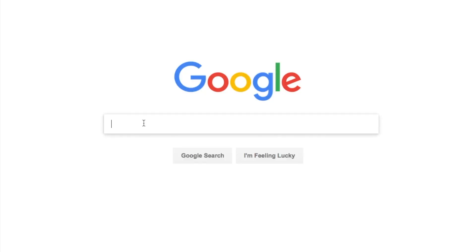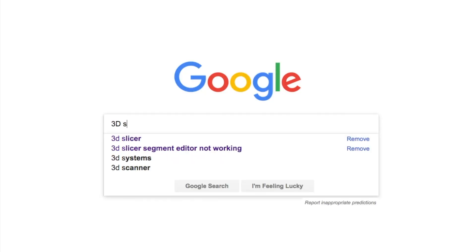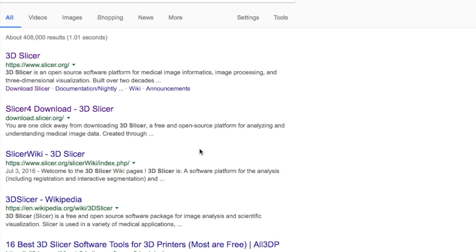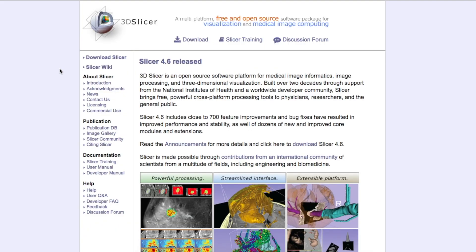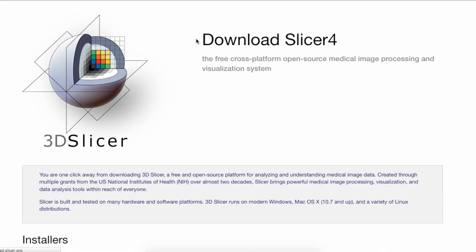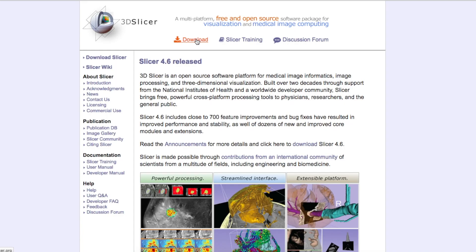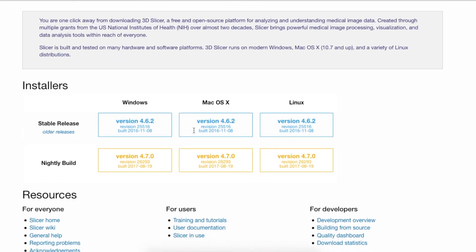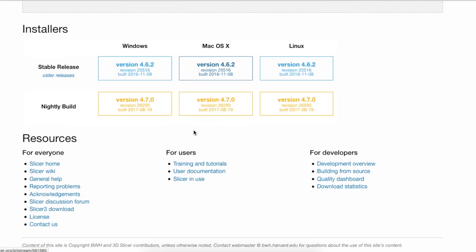Let's talk about how to download 3D Slicer. I'm going to go to Google, look up '3D Slicer', click on the first result, and it takes me to the website. Now I'm going to go to Download and scroll down.